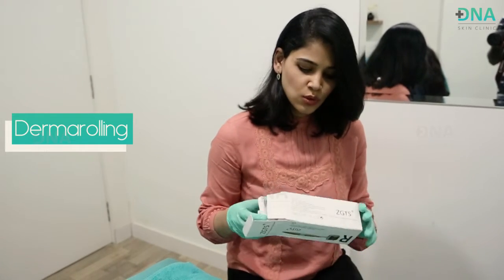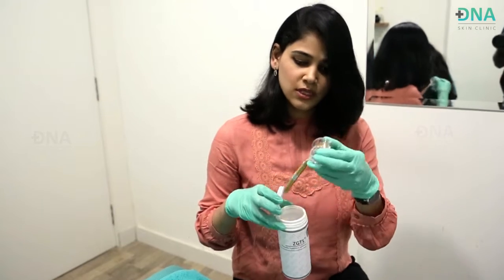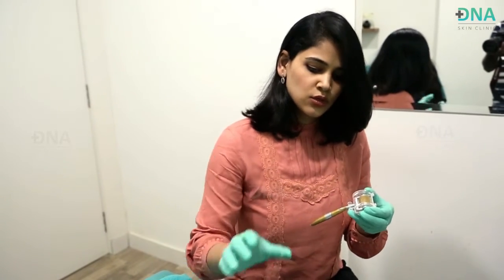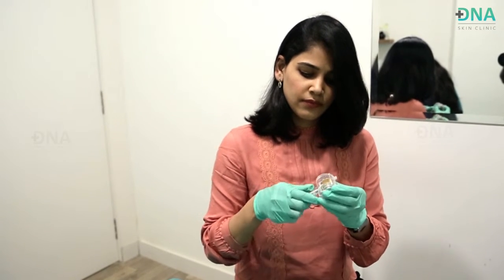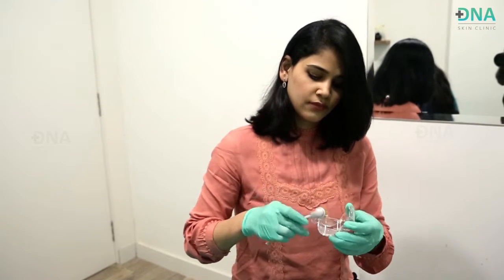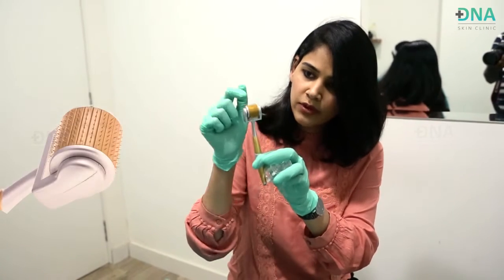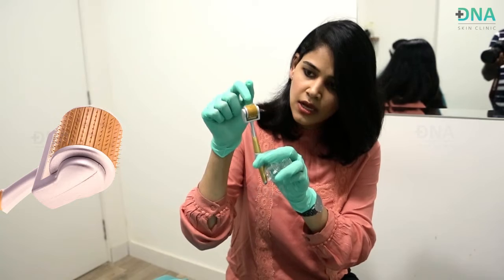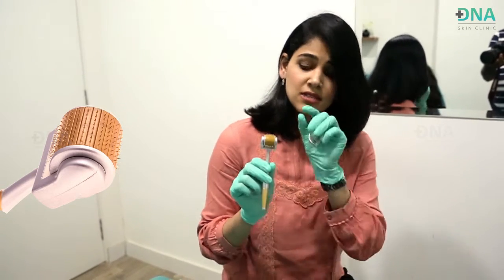Hi guys, today I'll be demonstrating a procedure called Dermarolling in an acne scar patient. For Dermarolling, I need a tiny instrument called a Dermaroller. A Dermaroller is essentially equipped with many tiny needles. If you observe closely, the Dermaroller is equipped with many tiny needles. It also comes in various sizes, that is, the size of the needles.